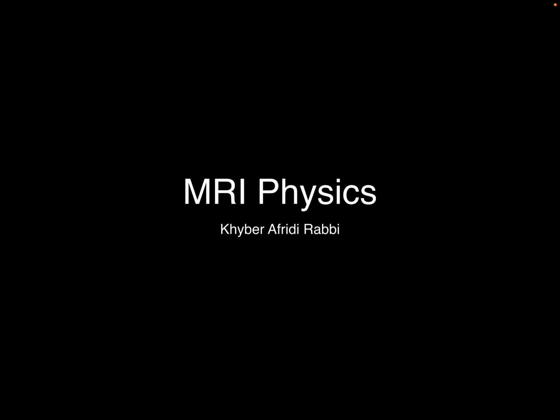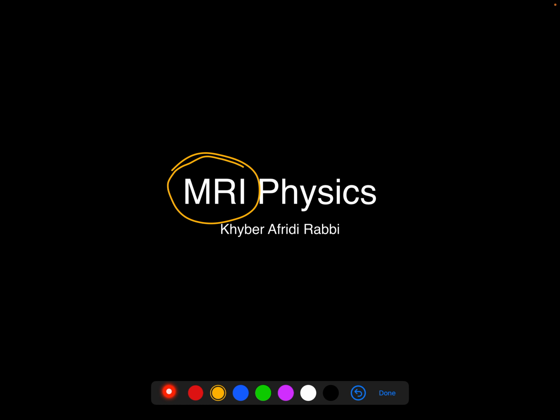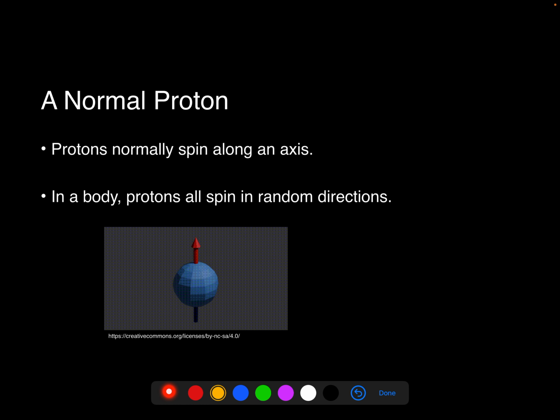Hello everyone, and welcome to our first video on the physics of an MRI machine. Whenever we concern ourselves with the physics in an MRI machine, we look at protons almost exclusively.